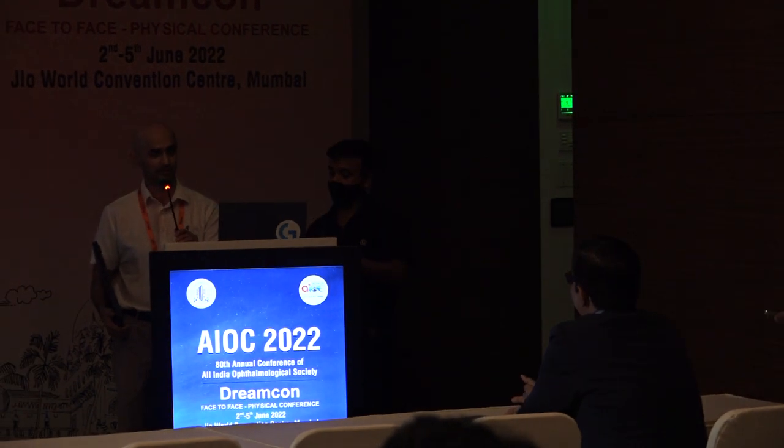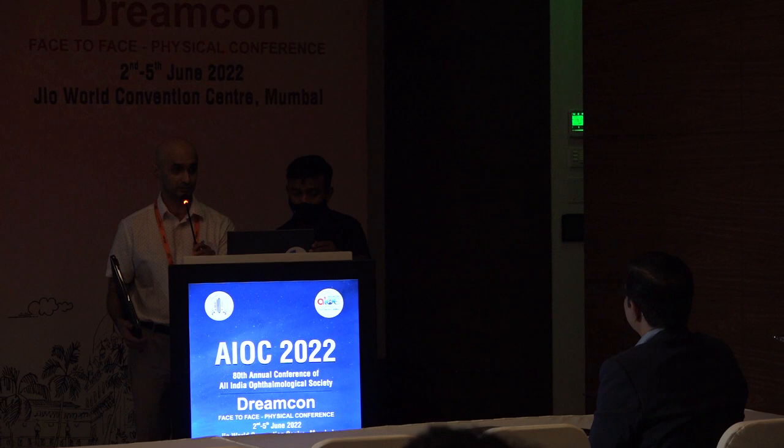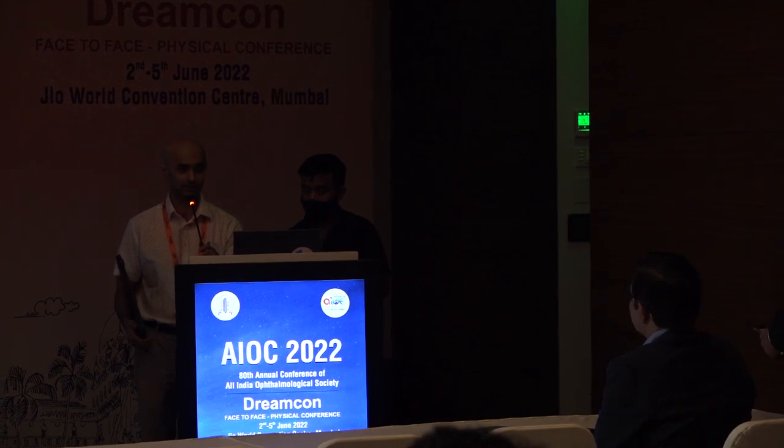Frankly speaking, it depends on the kind of situation that I am in. If I am operating on a patient and on table I have a PC rent where the capsular support is inadequate, I would generally end up doing iris claw IOLs because I think the time is very short to manipulate the situation on table. Whereas if I have a planned aphakia patient for management, I would generally do a SFIOL, either a sutured SFIOL using 6-0 Prolene or the Yamane's SFIOL.